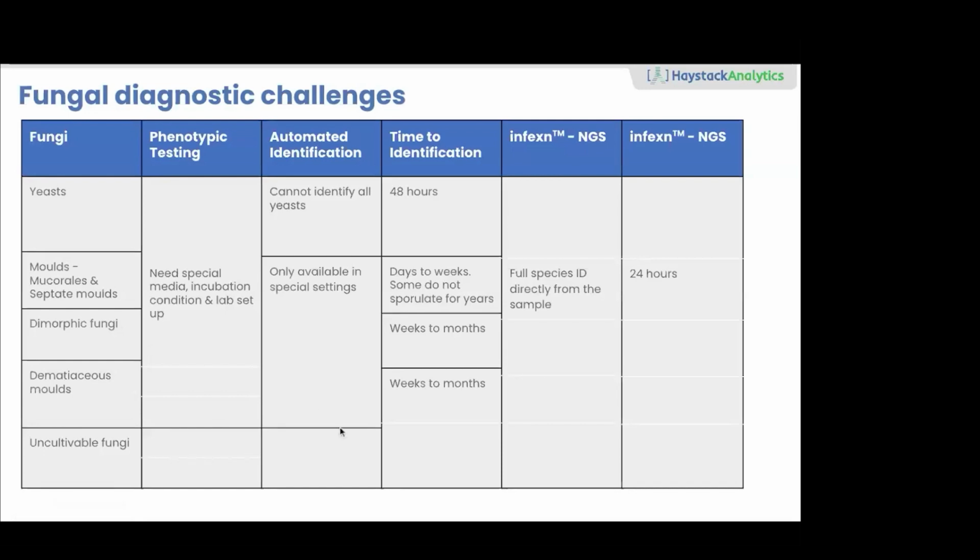So the availability of microbiological tests that I can give to any clinician who requests me, saying, listen, I have a patient, I need to diagnose this, becomes very constrained. It becomes a very constraining affair for a microbiologist. And the time to identification: certain yeasts will take 48 hours, sometimes even less than that, but for certain molds, like in this particular case, Fusarium, it takes longer.